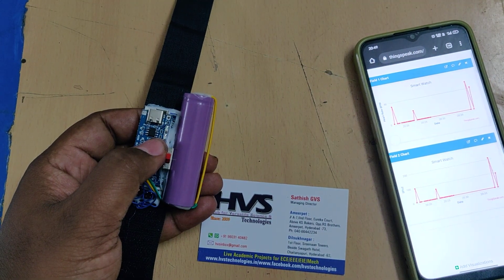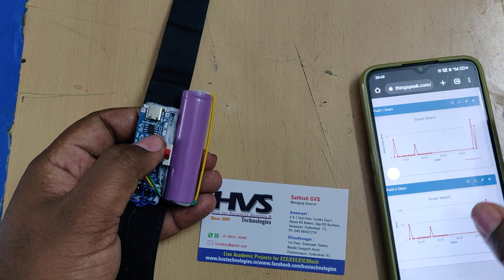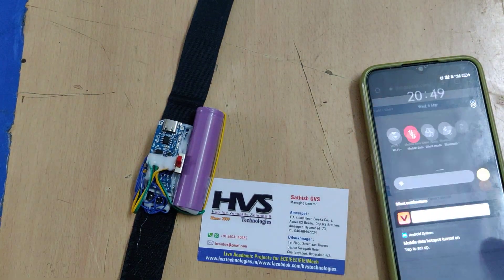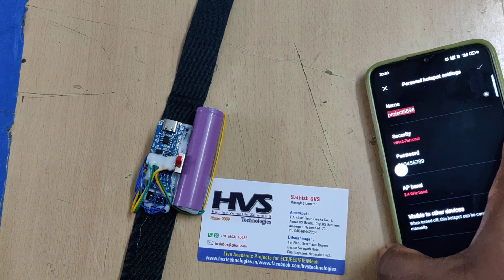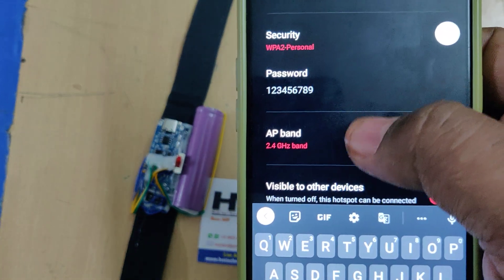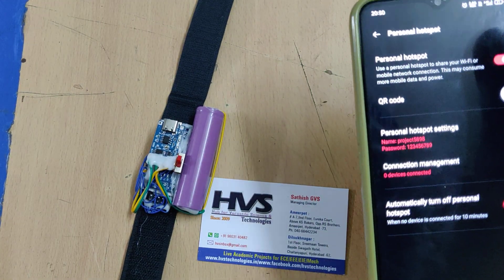Before executing the project, the very first step is to keep the battery on full charge. The next step is to turn on the hotspot on your mobile phone. Go to hotspot settings and change the hotspot name to 'project5898' — no spaces, no capital letters. The password should be '123456789' and the band should be 2.4 gigahertz. Then turn on the hotspot along with mobile data.